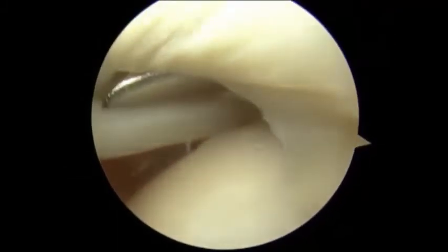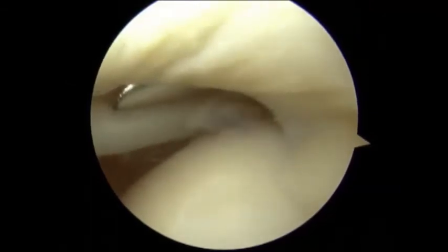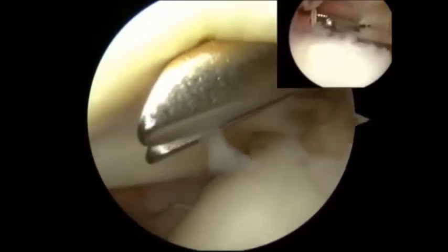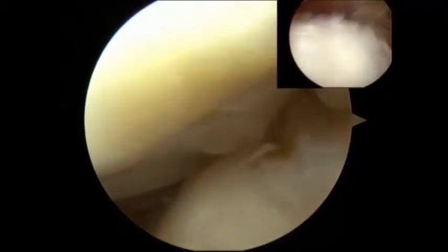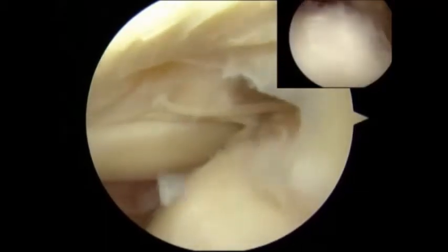The suture passer is being shown passing the suture in the exact location as selected by the surgeon. Notice the proximity of the suture to the biceps. Care is being taken not to over-tighten the tissue right next to the biceps tendon in order to avoid postoperative stiffness.